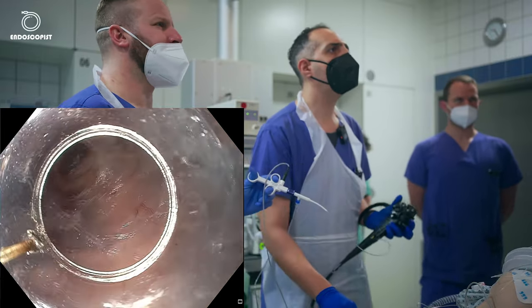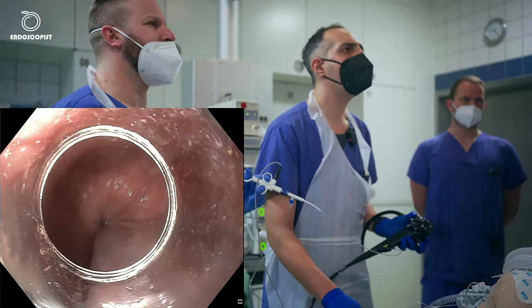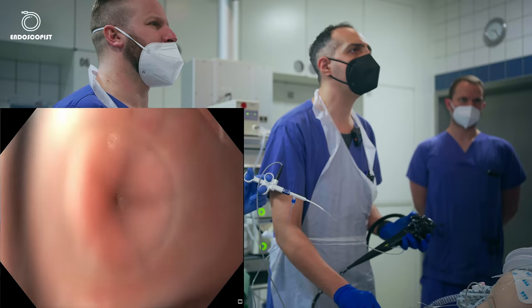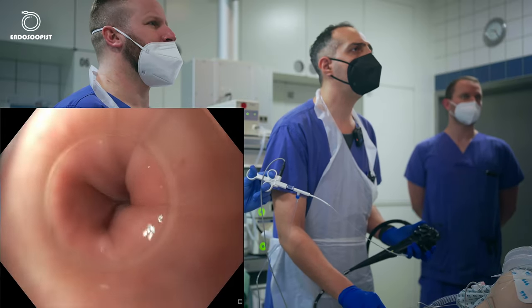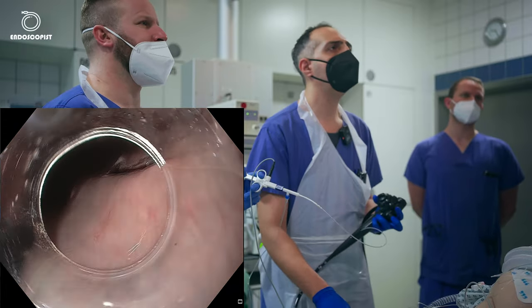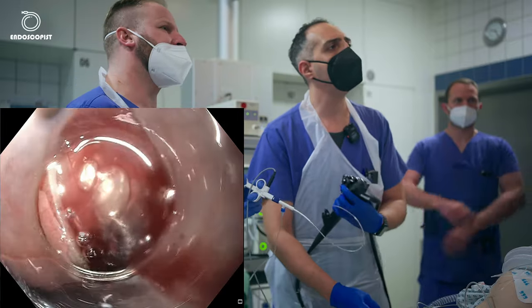Okay, I will go outside now again to have a quick look. We are here. Yes. So we are reaching the cardia. That's why it's quite difficult right now. But it's fine. That's a video. So I will go again in the tunnel.